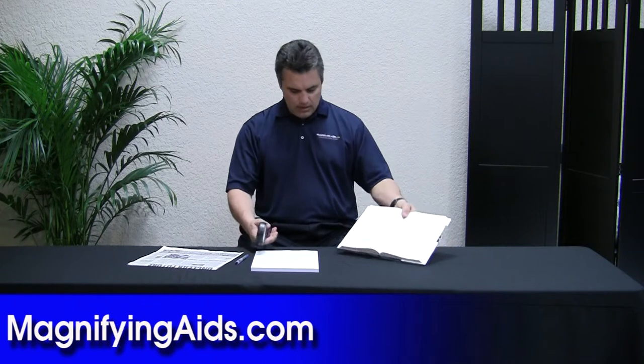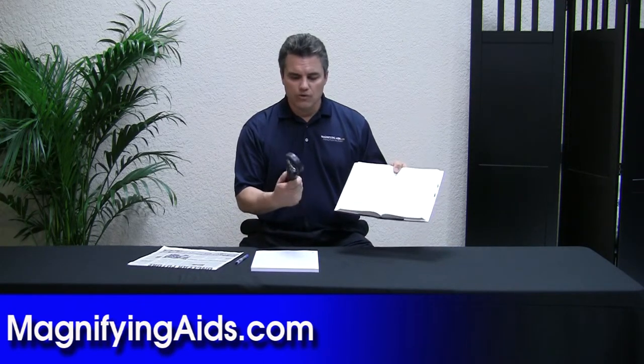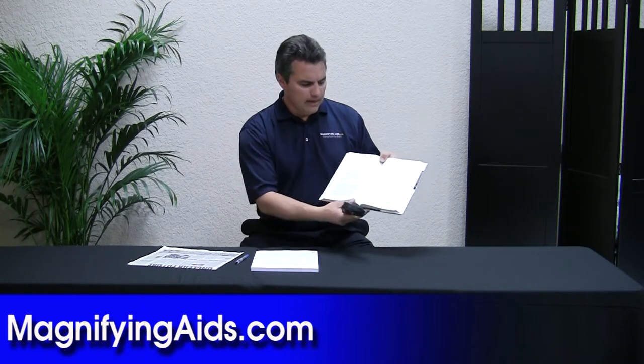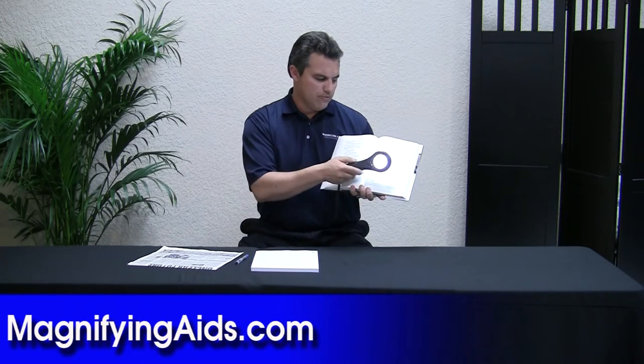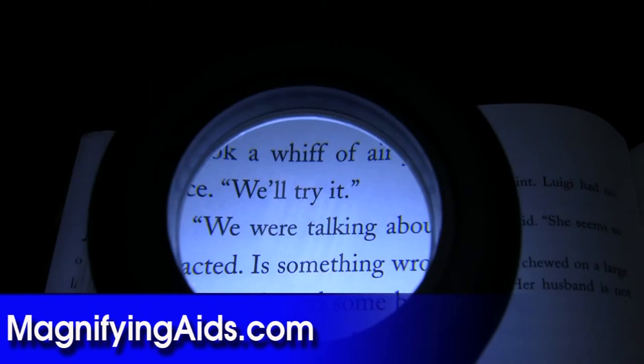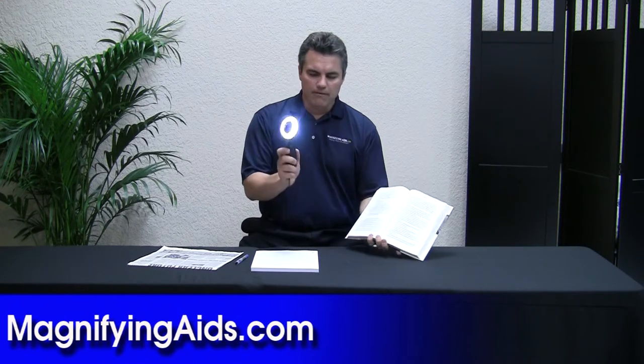It's pretty lightweight — the unit only weighs about 5 ounces, so it's very lightweight even with batteries in here. Real simple: just hold the magnifier up against the reading material, then you would bring your eye a little bit close, and then you would just read from left to right.